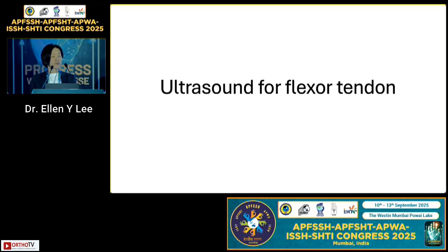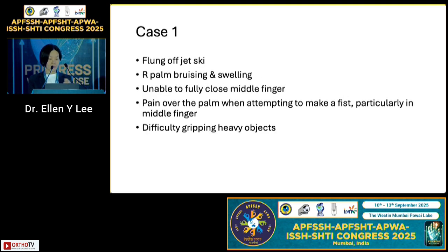Specifically for flexor tendon, no, I do not do ultrasound guided trigger release. Trigger finger is usually, in my practice, a clinical diagnosis, except when it is not actively triggering and you're trying to figure out in your head, is this really a severe trigger or is it something else? That's when the ultrasound comes out.